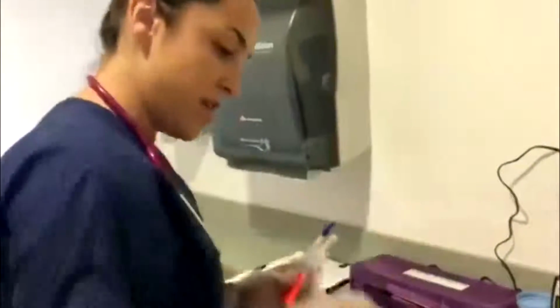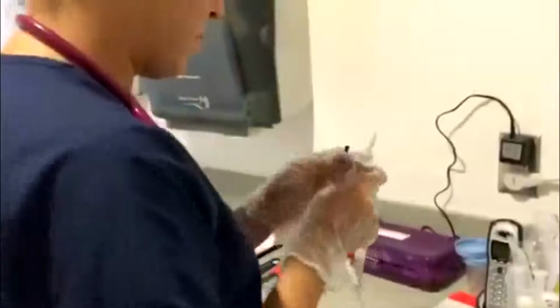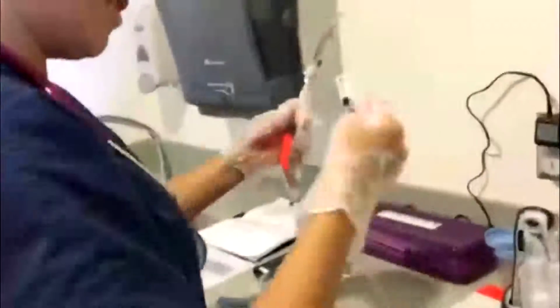Right. Same with this. I want to make sure to maintain sterile technique and that the clamp is closed. Twist, turning motion. Okay, great. And the clamp is closed.